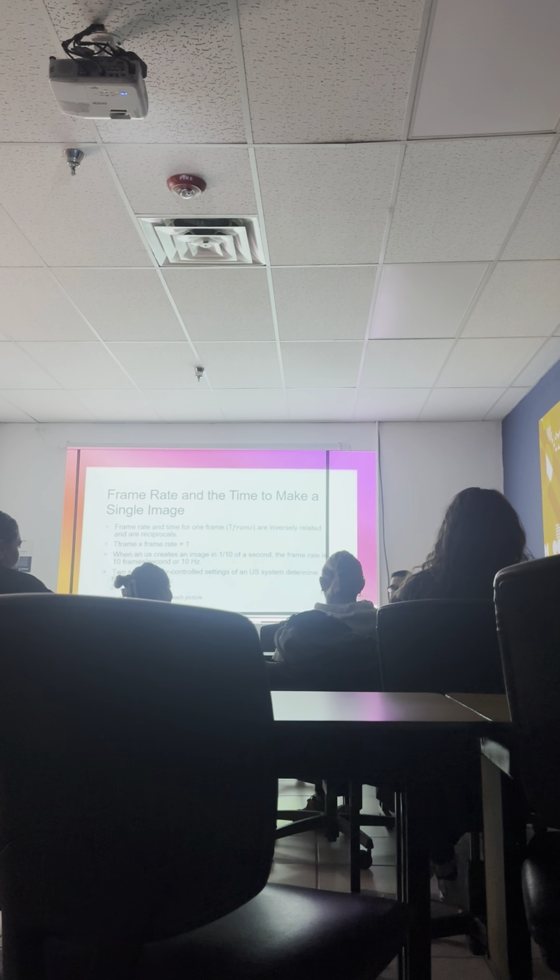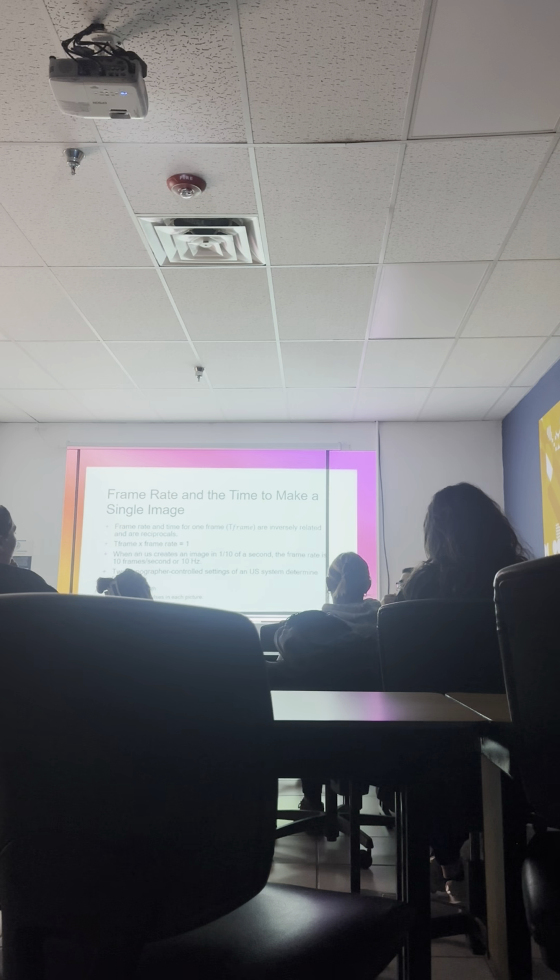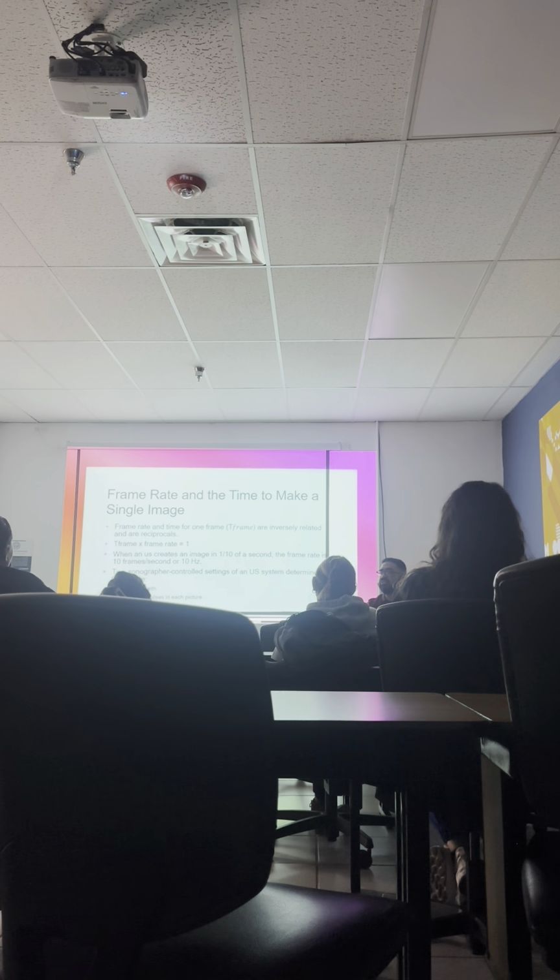Exactly. So if we have more pulses per scan line, it's true, our resolution is better, our pictures look better, but at the cost of the frame rate. So if our frame rate goes down, our temporal resolution goes down.